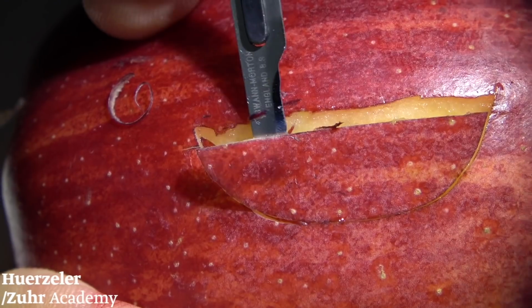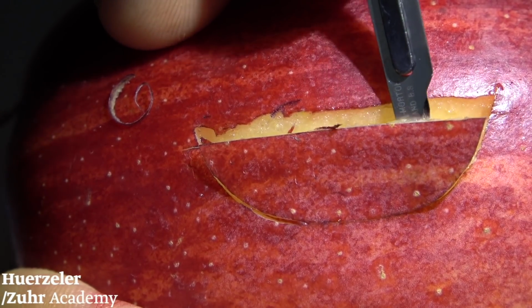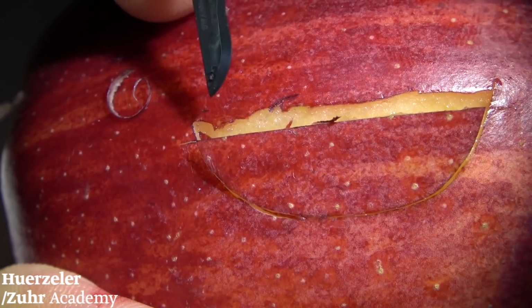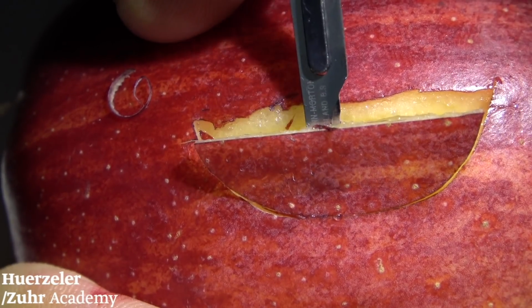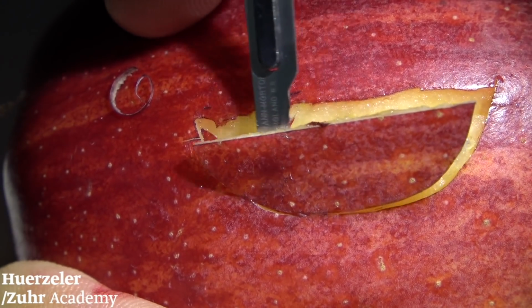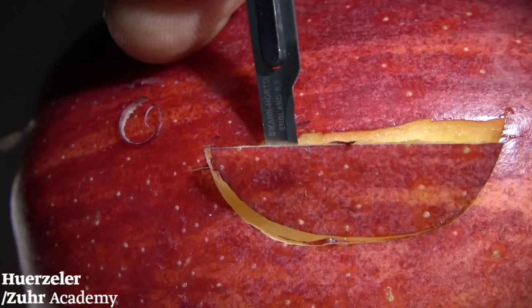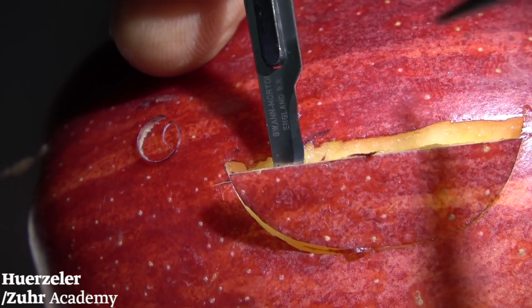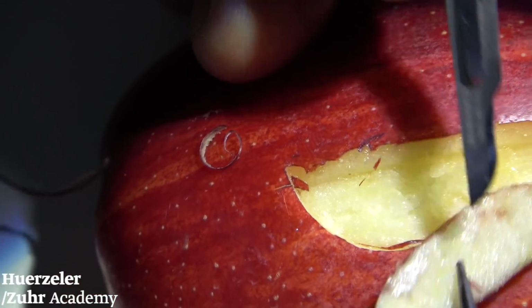I parallel to the surface, I'm preparing parallel to the surface and push the tissue out like this in this direction, and I go deeper and deeper and avoid any blade. Now look at this. I haven't used any instrument. Now we have a look together. Let's have a look together.